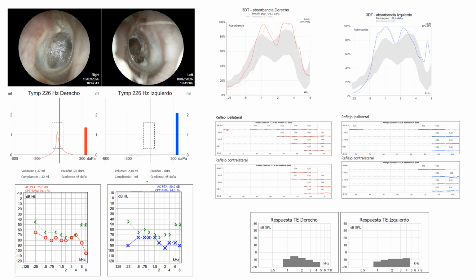When we compare with other tests, we find absent reflexes, no OAEs, and severe sensorineural hearing loss in both ears. So, the hearing loss is cochlear. The perforations only change the mechanical behaviour, and this appears as a pattern in WBA.